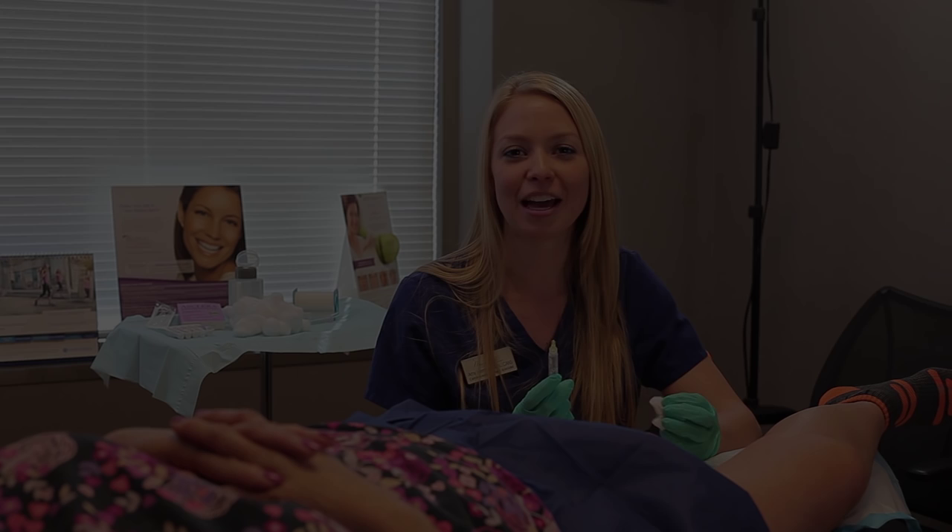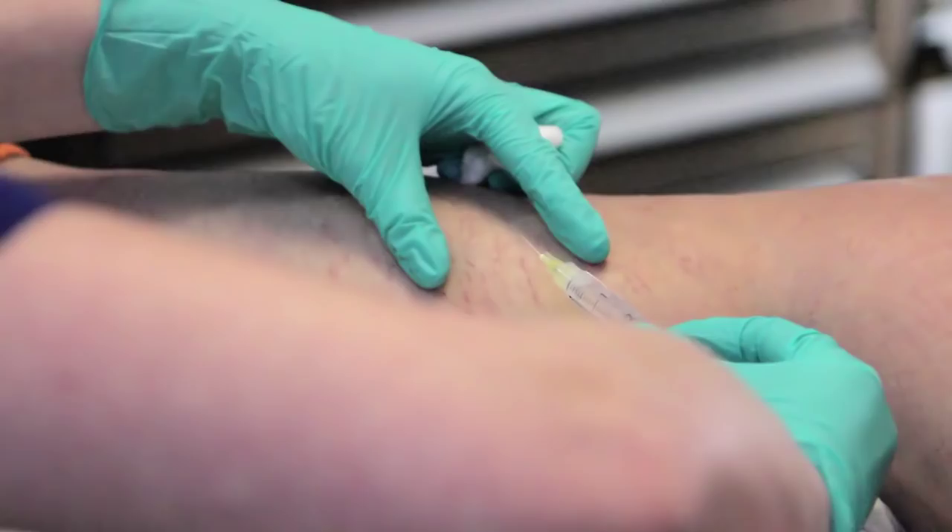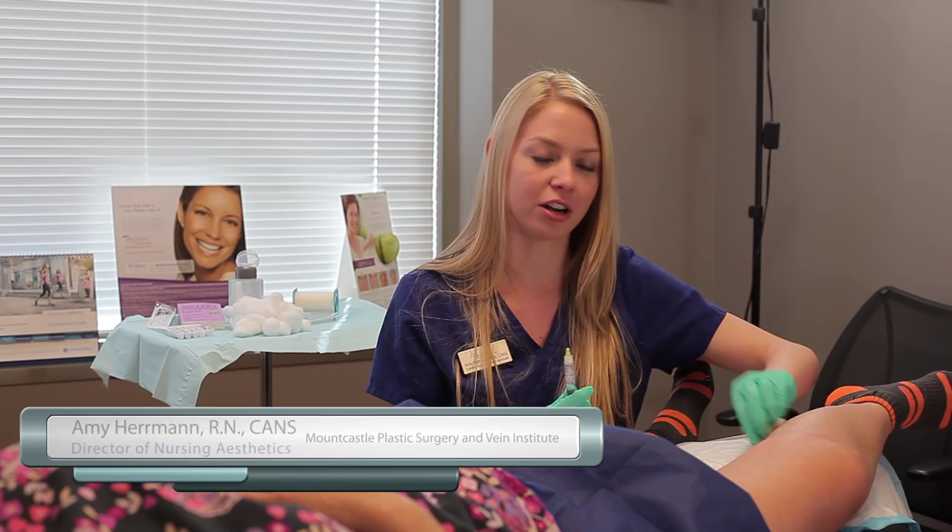Hi, I'm Amy. Here today we are going to perform a spider vein treatment called sclerotherapy. We have Frances helping us out today. The first thing we're going to do is just disinfect the area with some alcohol.